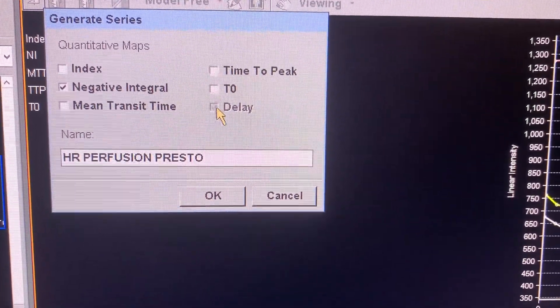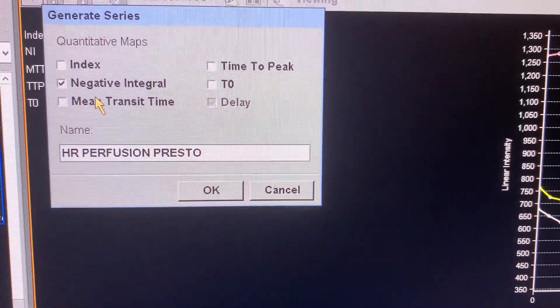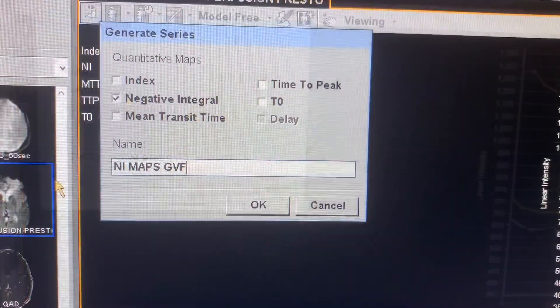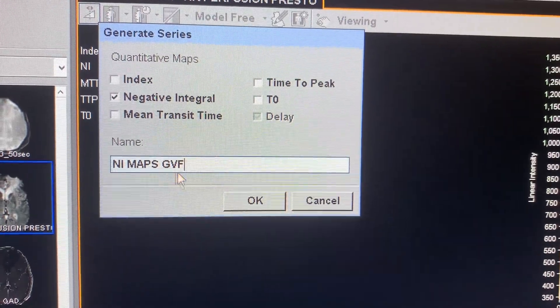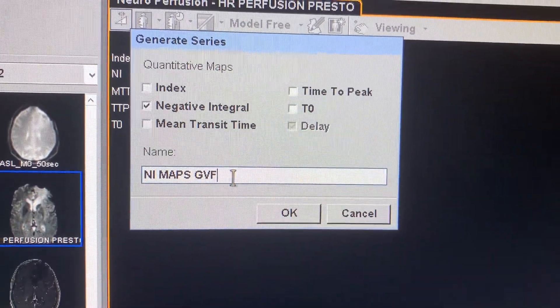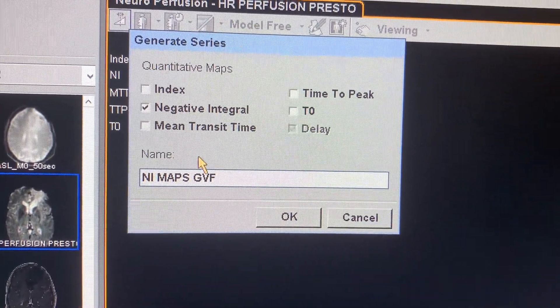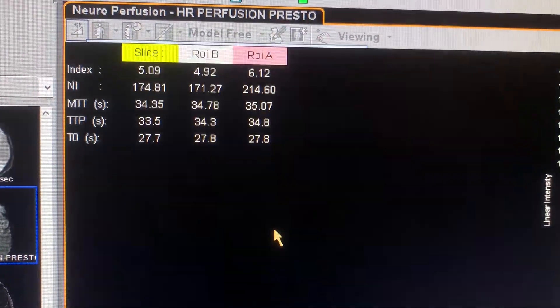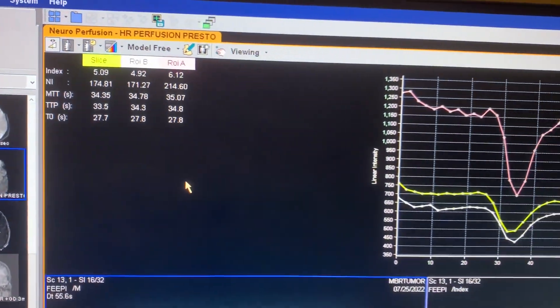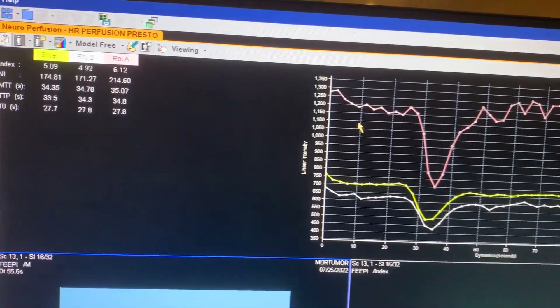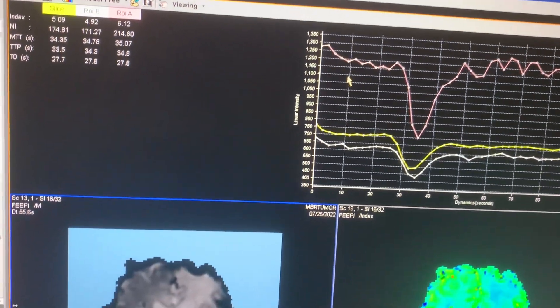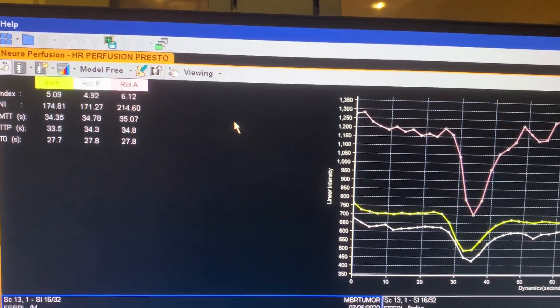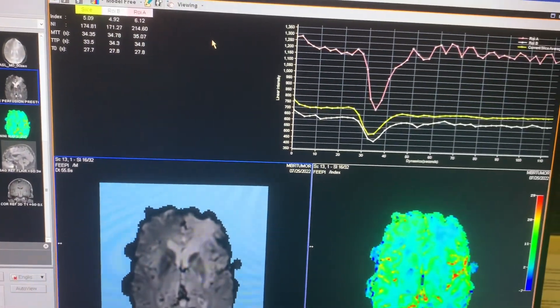Leave the NI checkmark, then type 'NI maps' in the name field and hit Save to send it to PACS. Then you're going to go back to do a second step with this app.